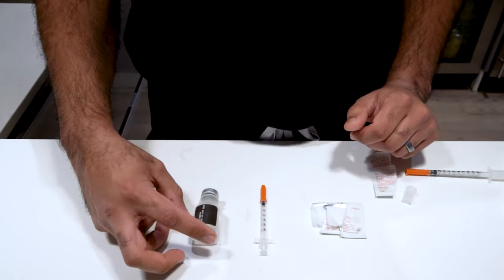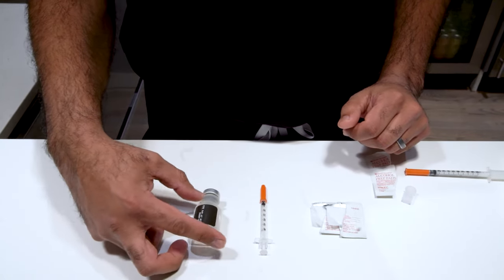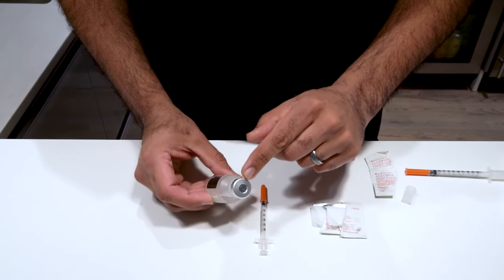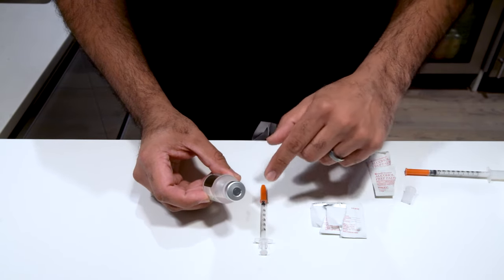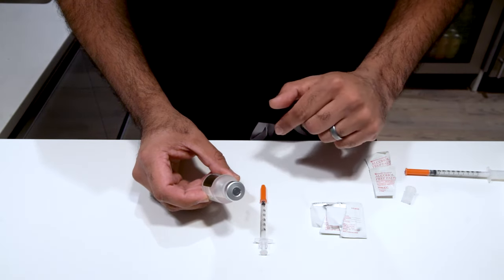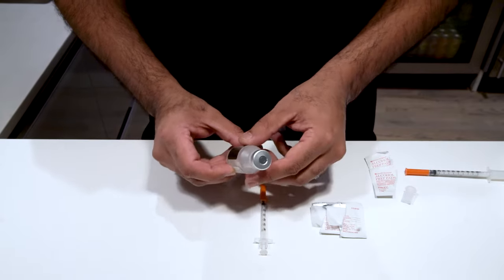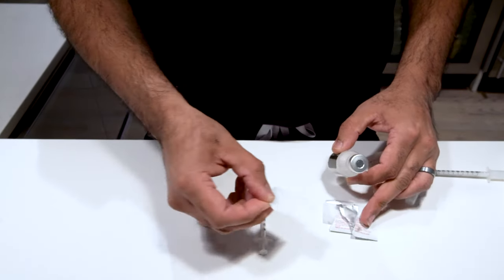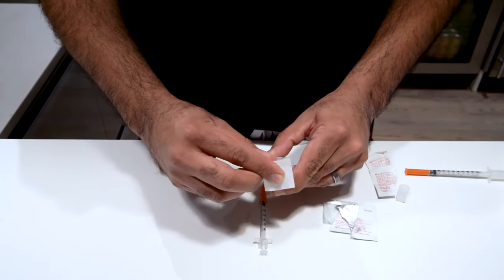Let's talk about getting the medication out of the bottle next. We're going to take our bottle. We saw that there is a little rubber plunger within the silver disc. We're going to want to put the needle of this syringe directly into that spot. But before we do that, we're going to take our first alcohol pad and we want to thoroughly clean that area.